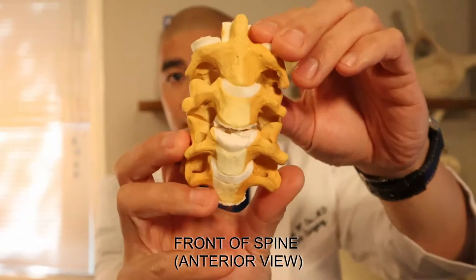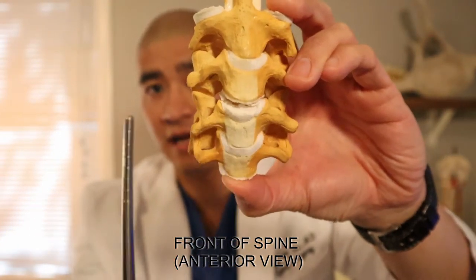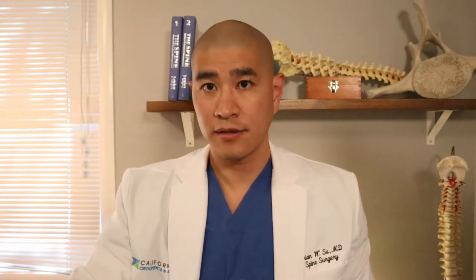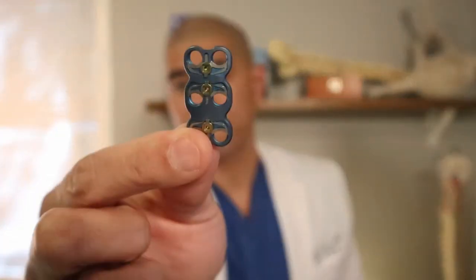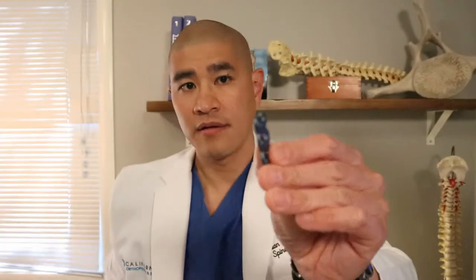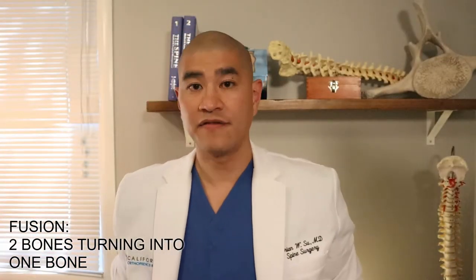Essentially what we do is, if this is the neck, we take the disc completely out from the front of the neck, and after we take it out there's a space — we can't leave that space alone. So in its place we put a piece of bone graft or a cage, and then we put a plate and place screws through the plate into the bone, making it a fusion.